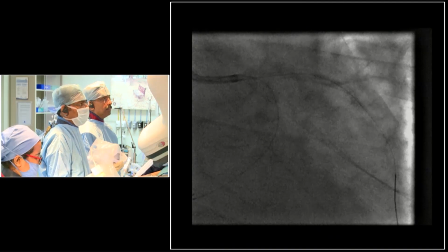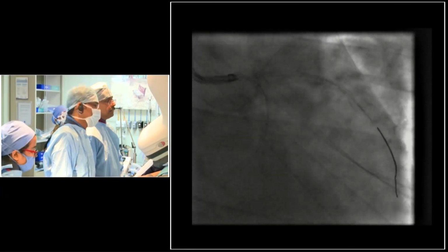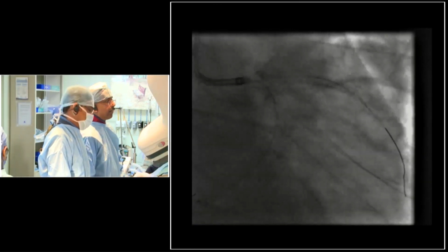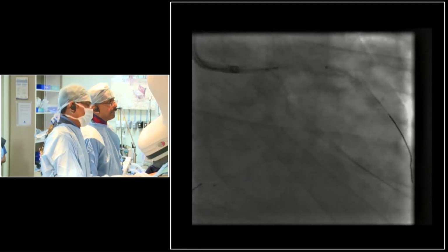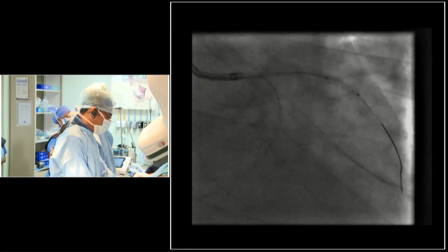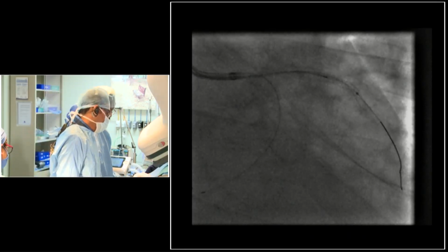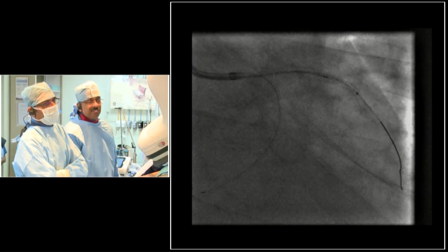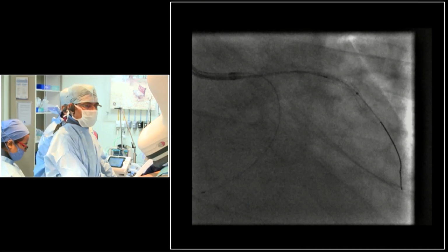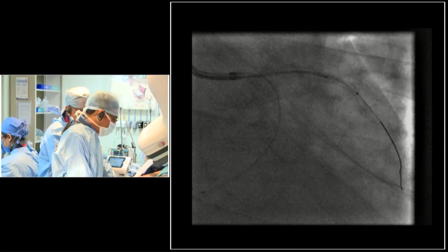And in a stable patient, ideally OCT and rotablation. Maybe Bhubadi might have seen a lot of Impellas and other things. What do you think, Bhubadi? This patient they would have done with the Impella, right? 100%, sir. There's no question about it. They would go with Impella and CP. Unfortunately, we don't have those.